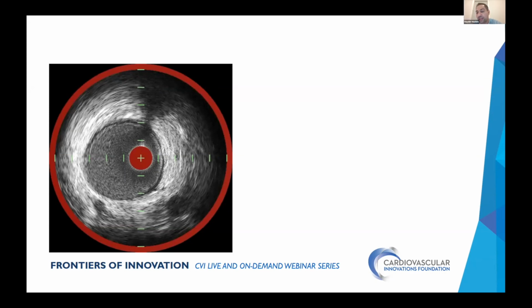Truly, I do believe in imaging, because where I'm coming from, our lab is heavily invested in a futuristic approach of forecasting vulnerable plaque, which plaque could cause a problem. Ron and myself were at OPCI over the weekend, and he presented on vulnerable plaque and risky plaque. So if I see a lot of lipid in an LAD in a young man like this or a young woman, I probably feel strongly to fix it if it's borderline FFR.